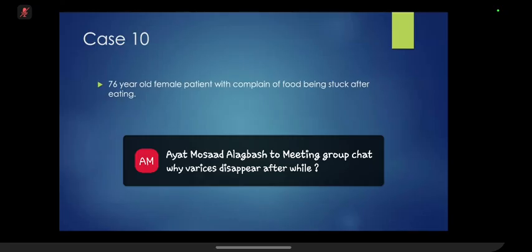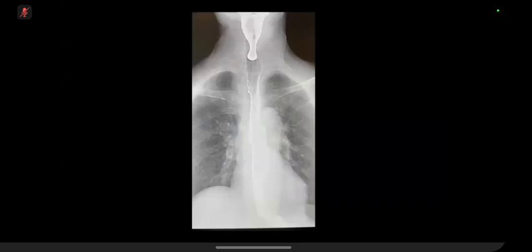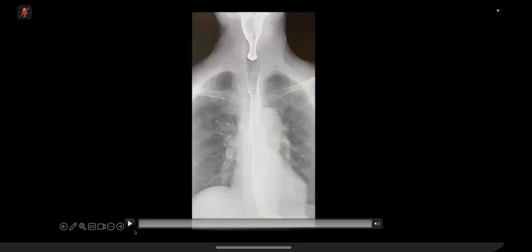So this is a 76-year-old female patient with complaints of food being stuck after eating. So these are a couple of videos.